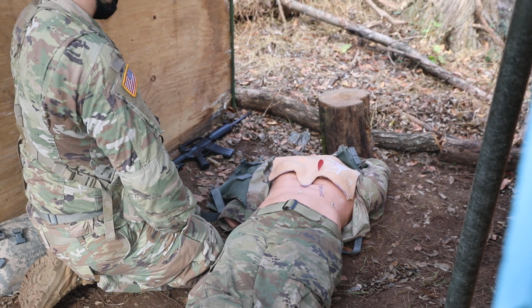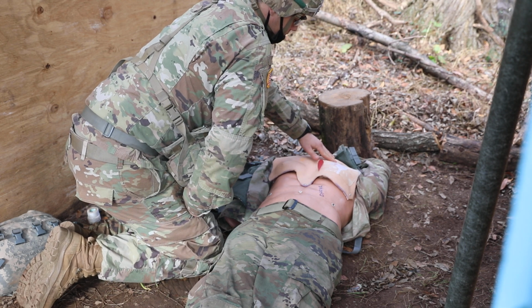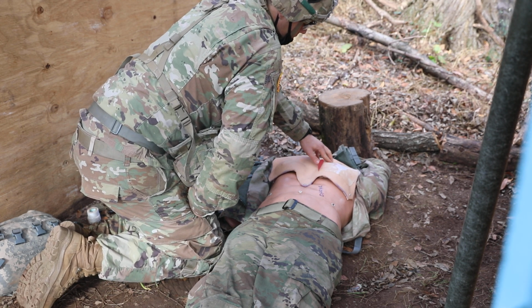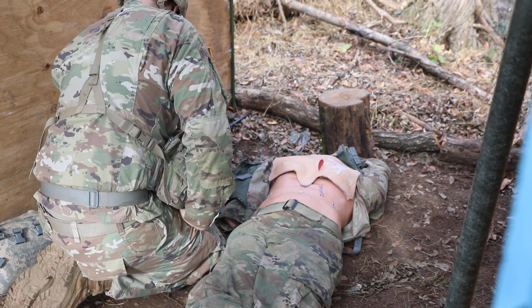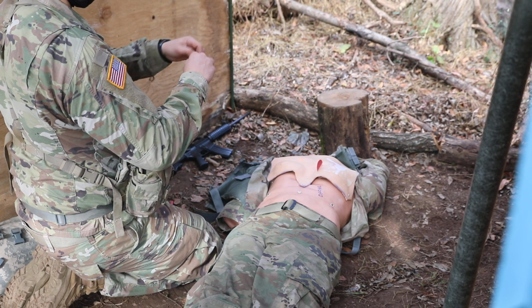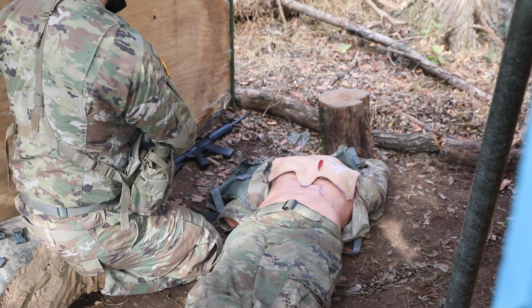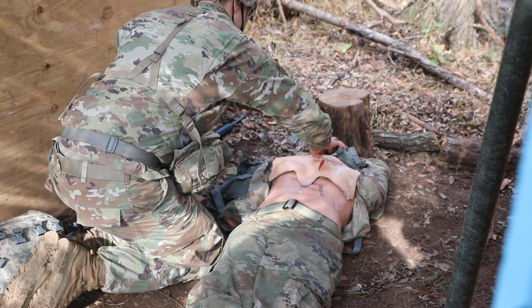Alright. Locate the insertion site. Locate the second intercostal space between the second and third ribs at the midclavicular line, approximately in line with the nipple, on the affected side of the patient's chest. Thoroughly cleanse a 3 to 4 inch area around the insertion site. Begin in the center and work outward using a circular motion.